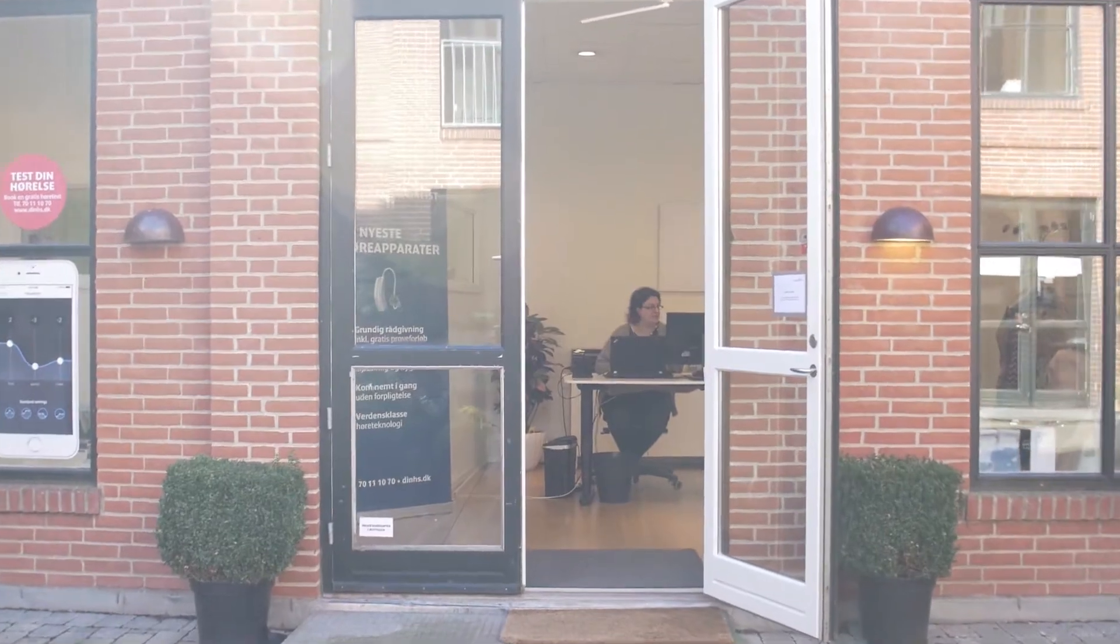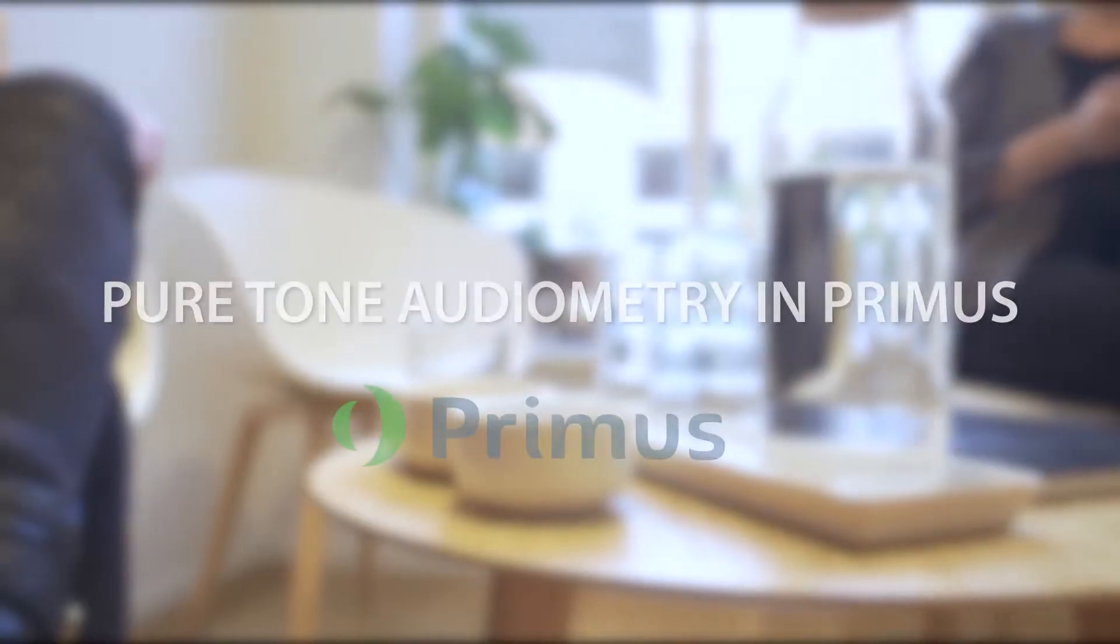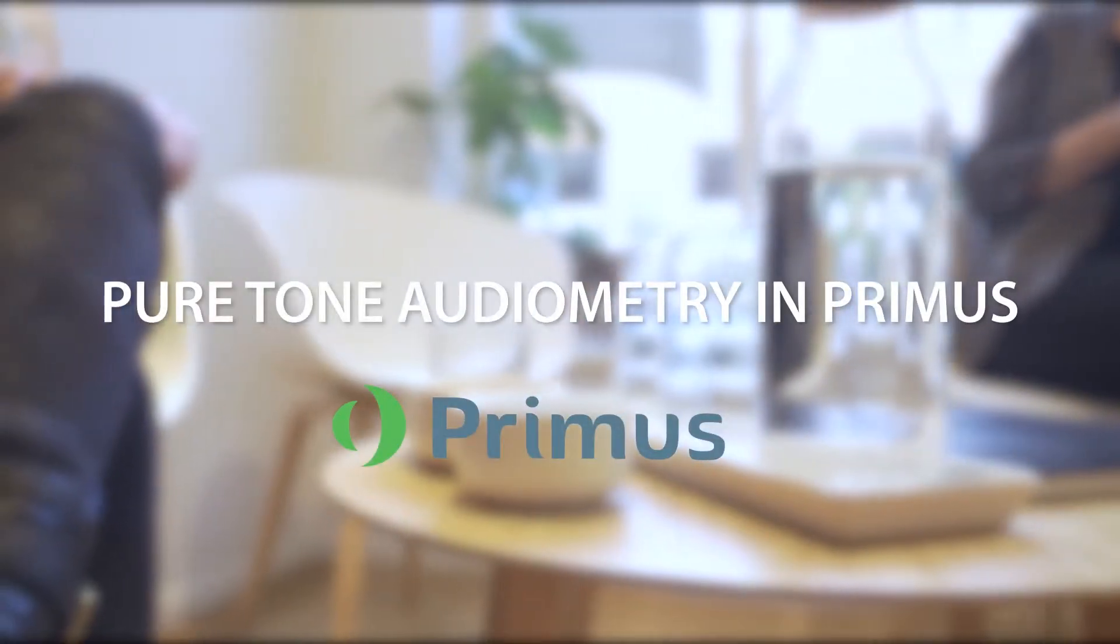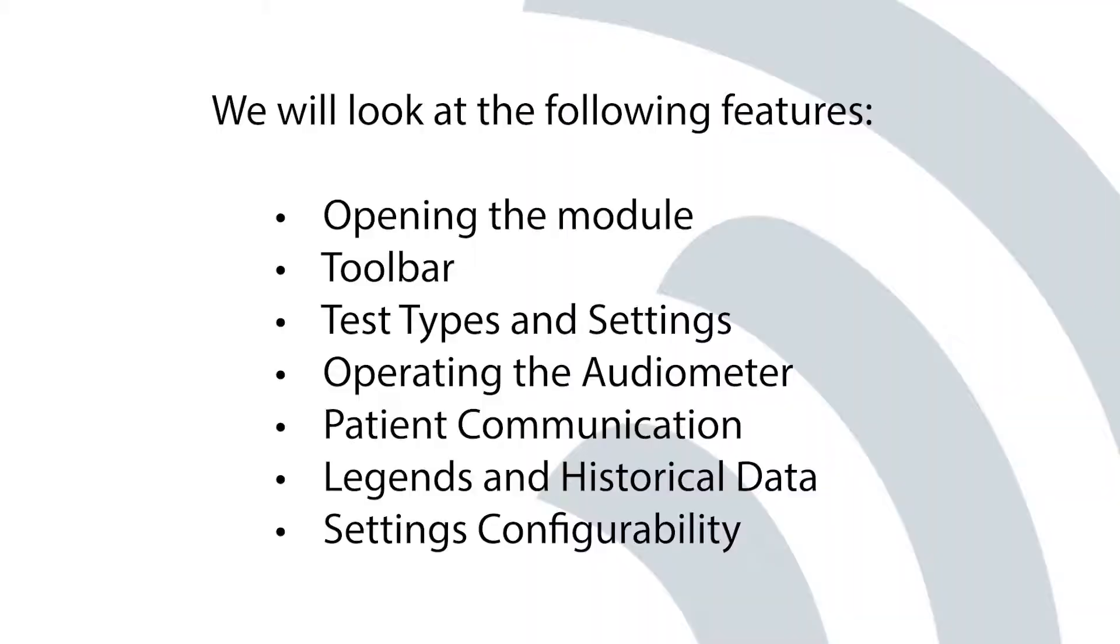Pure Tone Audiometry. In this video, you'll learn how to operate the Primus Audiometer.